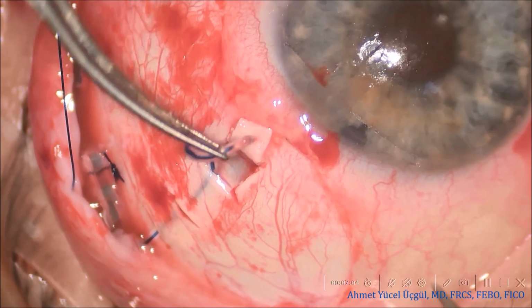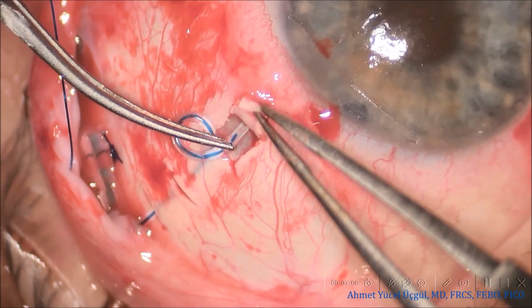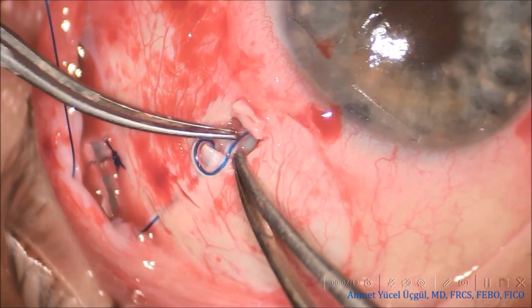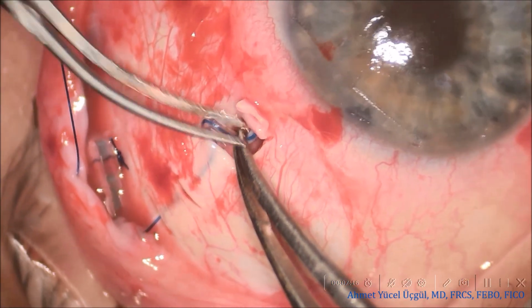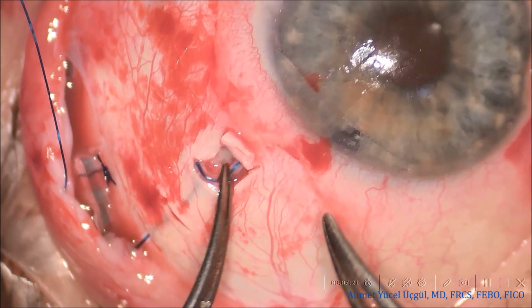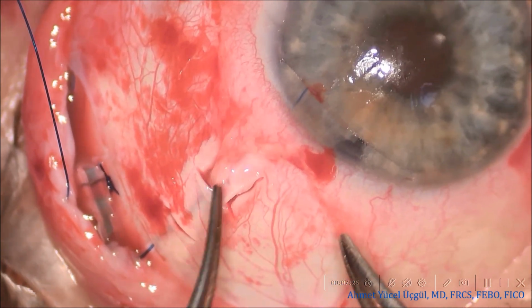When preparing the tube tip, I prefer a bevel-up cut for anterior chamber insertion and a bevel-down cut for sulcus placement. One important technical tip at this stage is that the more oblique the bevel is, the sharper the tube tip becomes and the easier it enters the eye. A well-fashioned, sharper bevel allows smoother tissue penetration and gives better control during insertion. In addition, bimanual two-point grasping of the tube improves control during advancement.